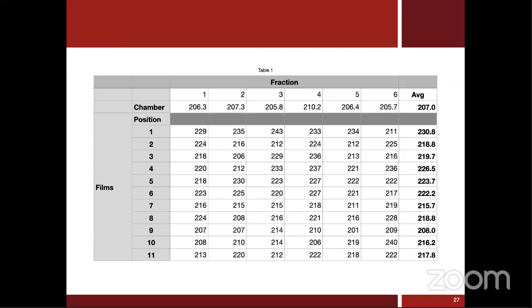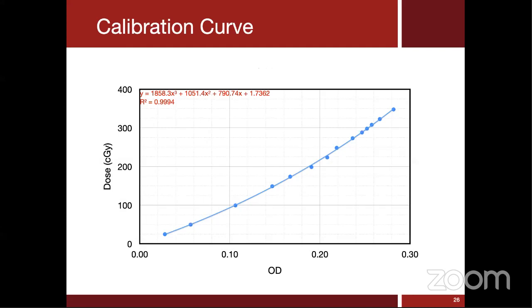How about scanning of the unexposed film, exposed film of known dose, and the actual dose, unknown dose film, all at the same time? Can it be done, or do we have to do it separately? No, you can. I think you can.